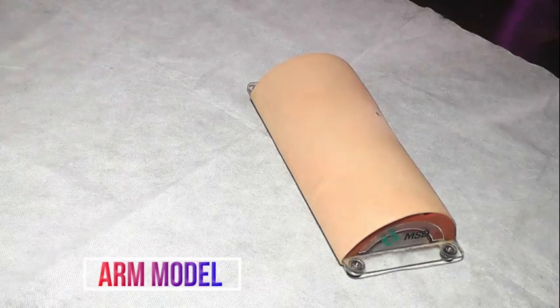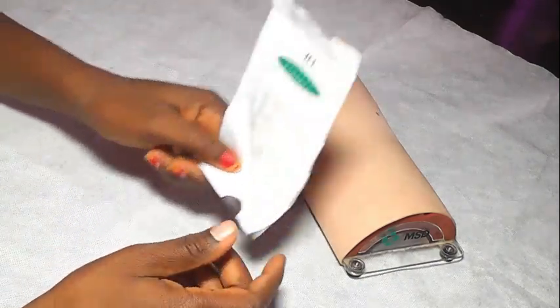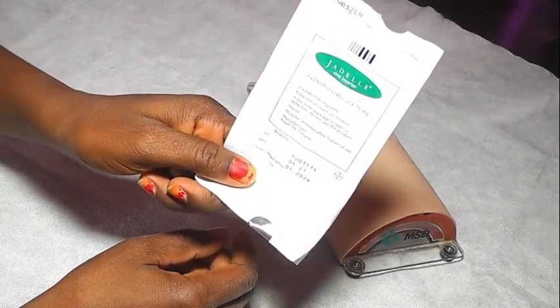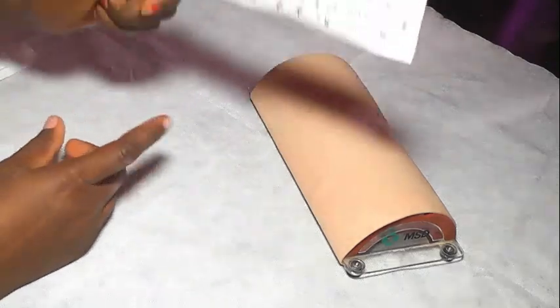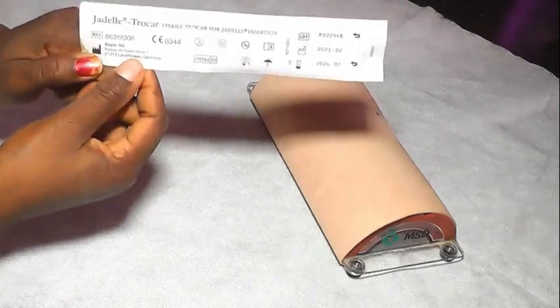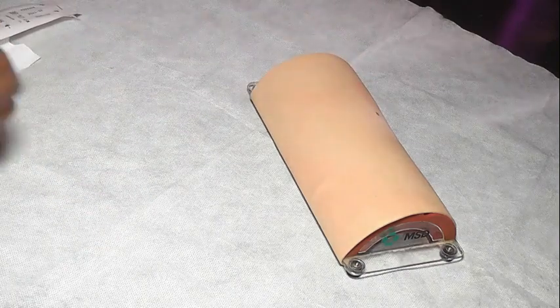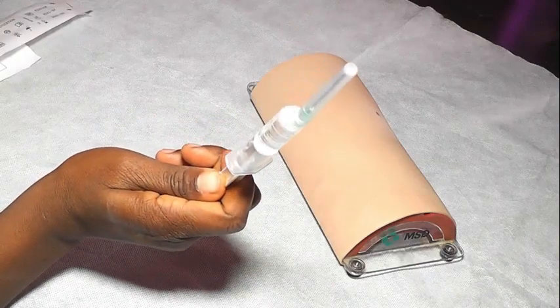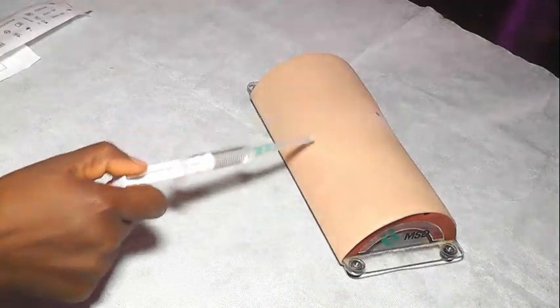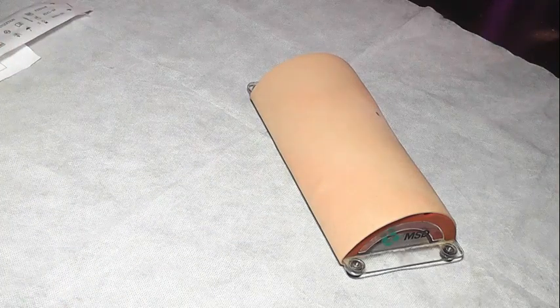Then I need the Jadelle. The Jadelle, you can see it. I need the trocar. Now this is the trocar for the insertion of Jadelle. Then I need 2 to 4 mils of xylocaine, which we can use to anesthetize the area for the insertion.